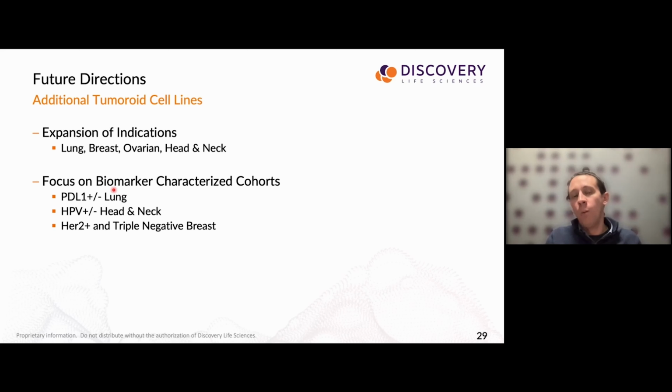Interesting for ovarian, one of the models we're looking at is not necessarily starting with associated tissue or associated tumor, but starting with ascites fluid from ovarian cancer patients, as that material already would be somewhat acclimated to a more suspension type format. And as really the theme for this webinar has been, we're going to focus heavily on biomarkers when we're developing these new lines. We really want models that are PD-L1 positive and negative lung, HPV positive and negative head and neck, and then really breast models where we know the hormone receptor status, but that we've got specifically HER2 positive and triple negative breasts. So really we can be very specific on the models we're generating.